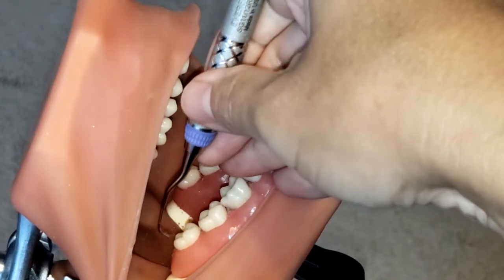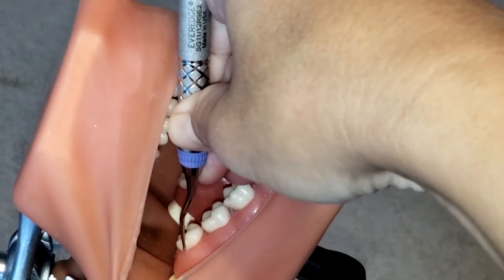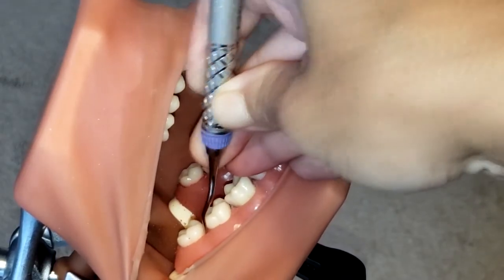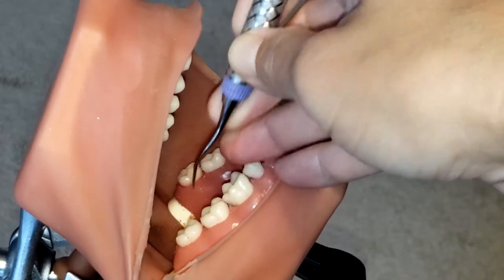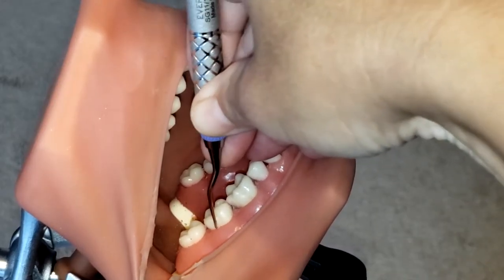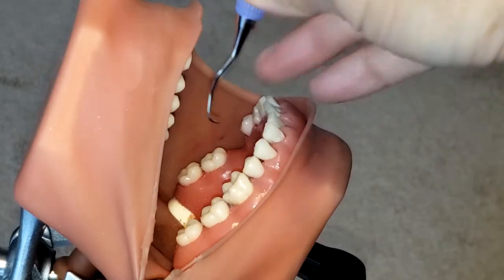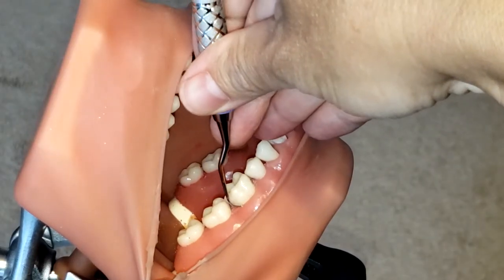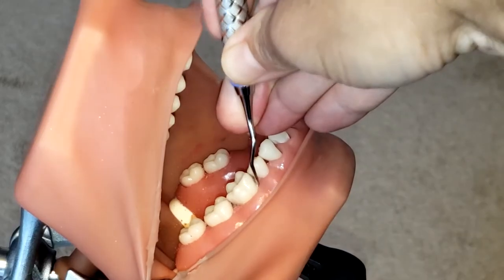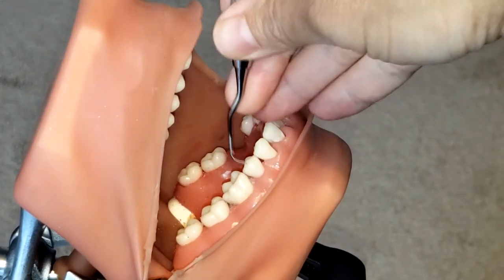We're going to start at the distal line angle, dive into that pocket nice and easy, and then scale using controlled overlapping strokes, rolling into that interproximal space, getting all that calculus from the col. Make sure you're using your vertical, horizontal, and oblique strokes. As you're going in and getting around towards the line angle, you begin to roll, and on the interproximal make sure that you are maintaining a 70 to 80 degree angulation for proper calculus removal.